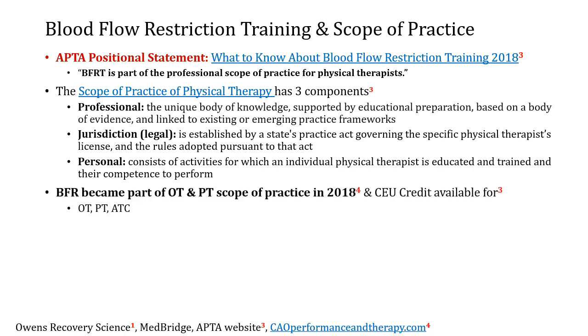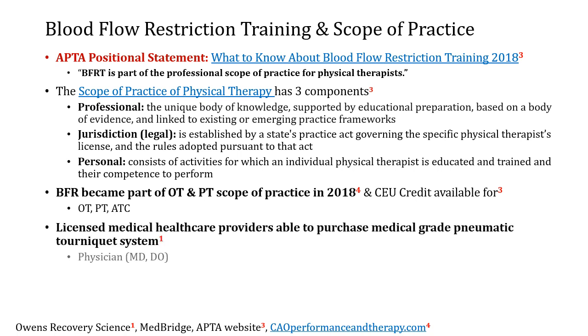That really falls on you, whether you know that you don't have to be certified necessarily. I think that it's certainly good to be educated. BFR became part of the OT and PT scope of practice as of 2018 based off my research, and CEU credit is available for all licensed medical providers, including ATCs. Licensed medical healthcare providers are able to purchase medical grade pneumatic tourniquets, such as the Delfi unit, with any one of the following licensures.